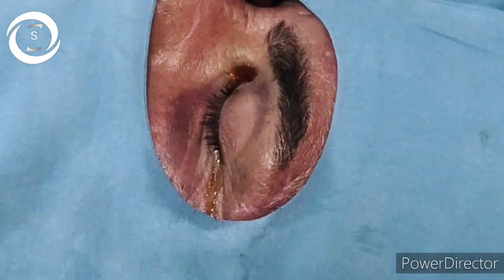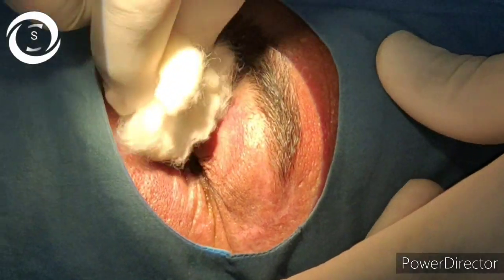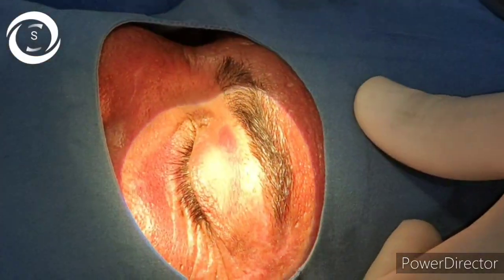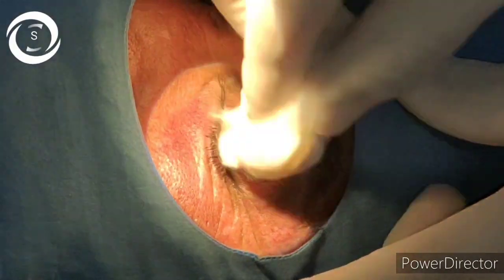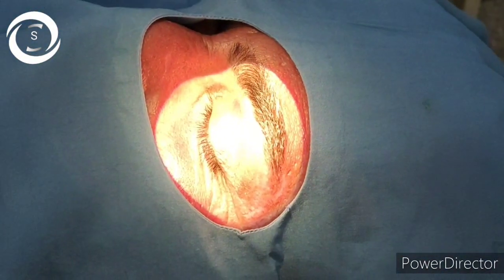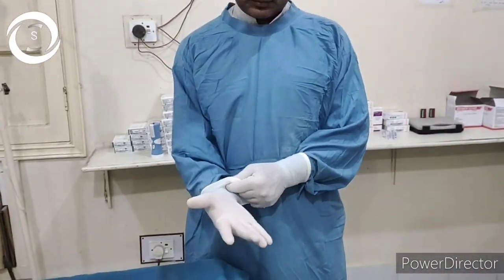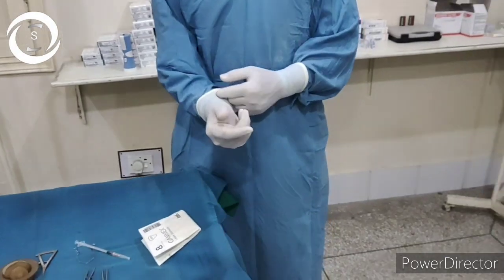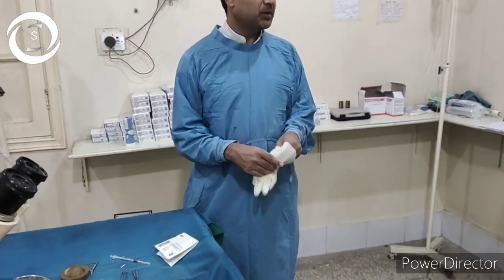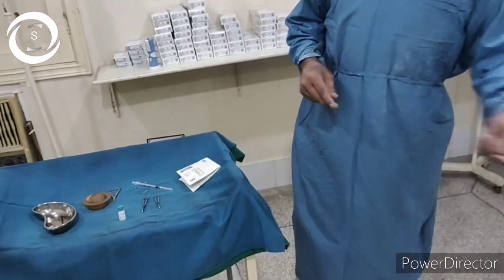So you should perform under sterile conditions. You should have a topical anesthetic, proparacaine. You should have povidone iodine. You should have a pair of sterile gloves. The OT should be well cleaned and sterile, and minimal personnel should be there. Remove the unnecessary personnel.